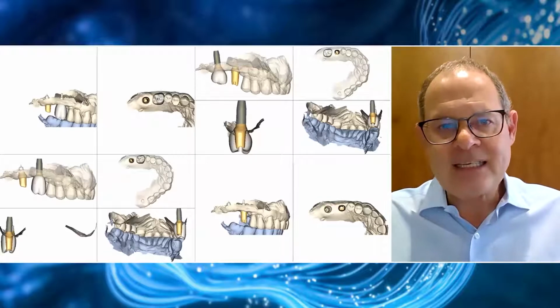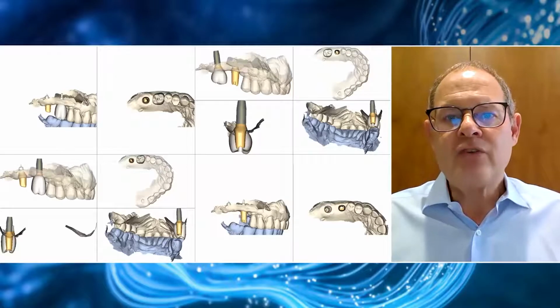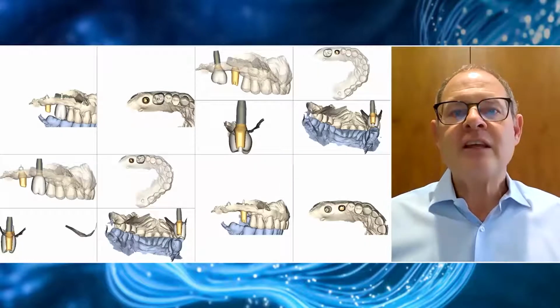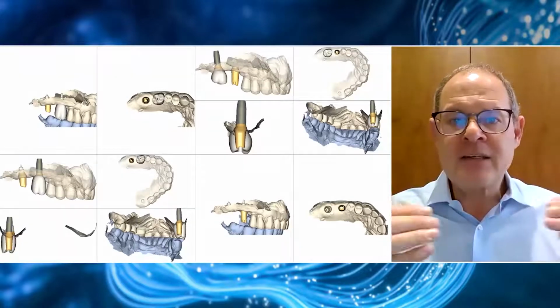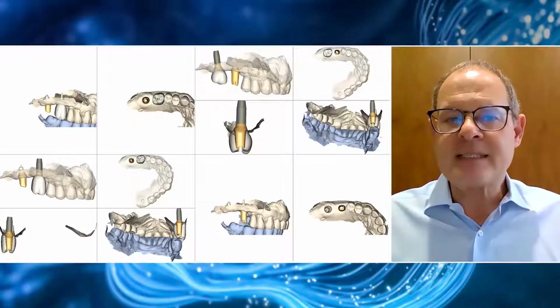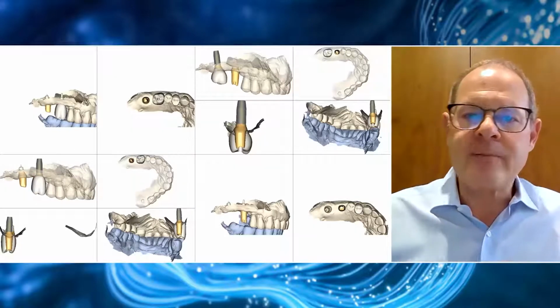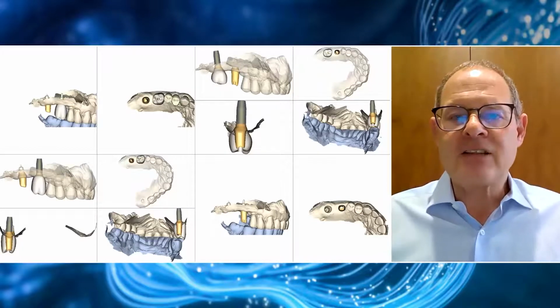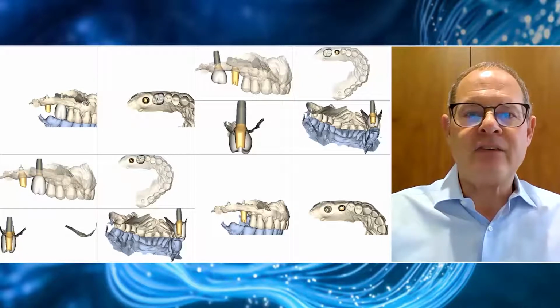That information is then sent to Atlantis, and using the virtual abutment design software, you see here, we can start to fabricate abutments with different emergence profiles, different core sizes, core tapers, different margin positionings. In fact, today I'm pretty much routinely using the custom base abutments, which are screw retained. So the crowns are going to be bonded in the lab and the whole structure is going to be screw retained. And so these margins can actually be placed deep into the soft tissues because we're not having the issue of removing cement intraorally.